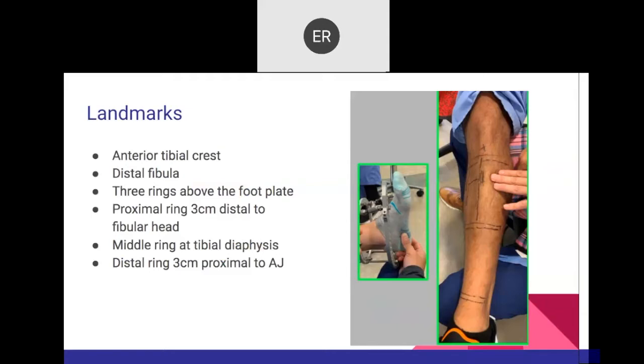It's very important to keep these parameters because the foot support should be a centimeter below the distal ring. That ensures you have a wire on top and below at the level of the calcaneus. The foot always has two components — the hindfoot and the forefoot — and both need two points of fixation. Every single segment needs two points of fixation for adequate stability.